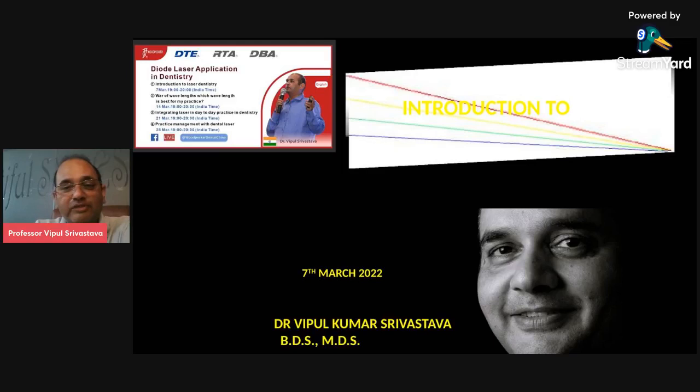Advances in laser technology have brought a revolution in dentistry. Now, what do I mean by revolution in dentistry? You need to understand where I keep lasers in general, day-to-day practice. When we talk about an endomotor, it is focused on endodontics. When I talk about a scaler, it is focused on periodontics. When I talk about braces and aligners, it is focused on orthodontics. But laser is one tool which has application in almost all the streams.